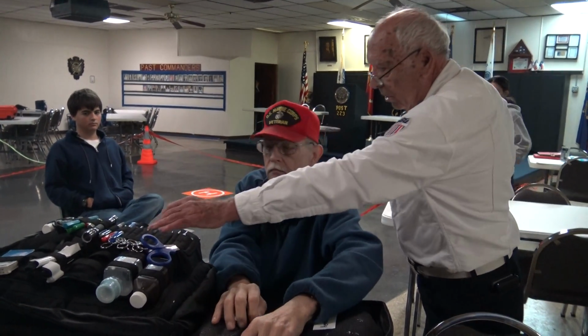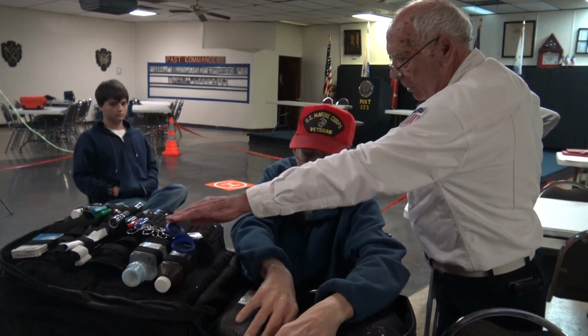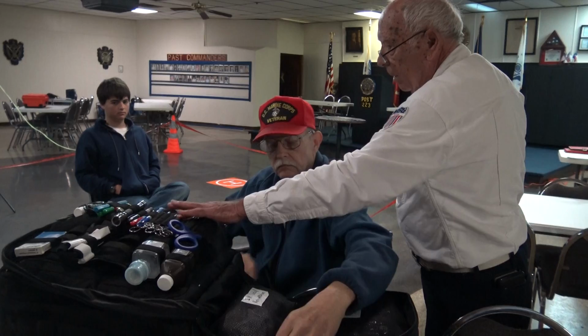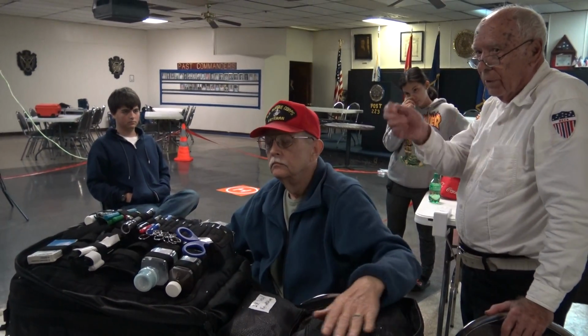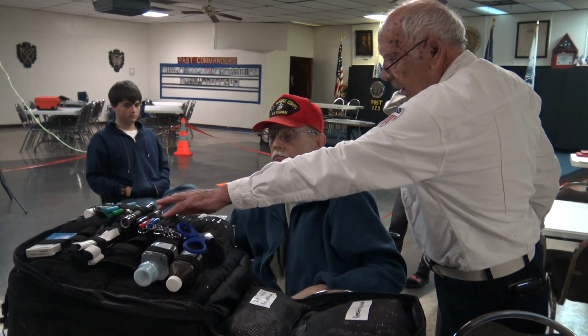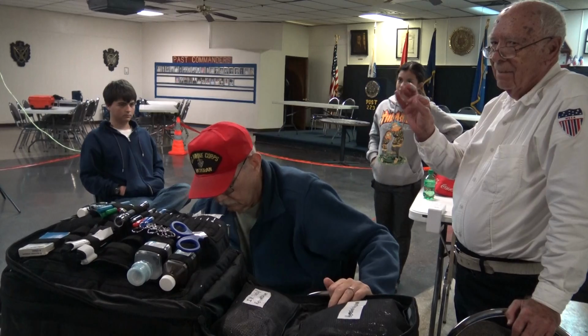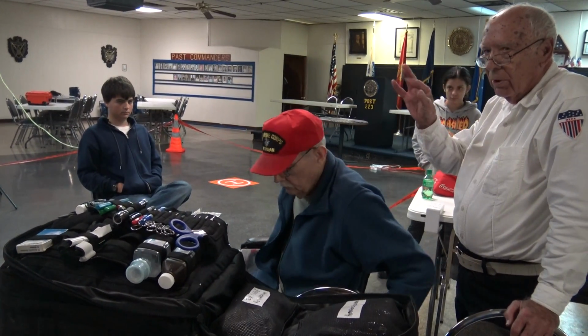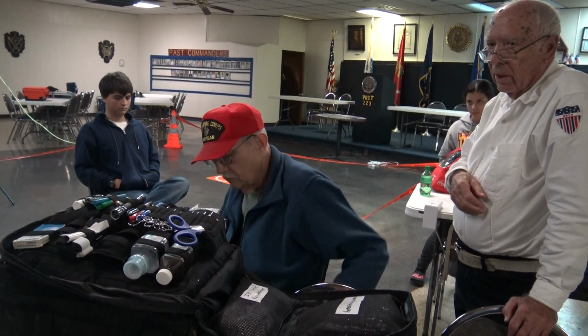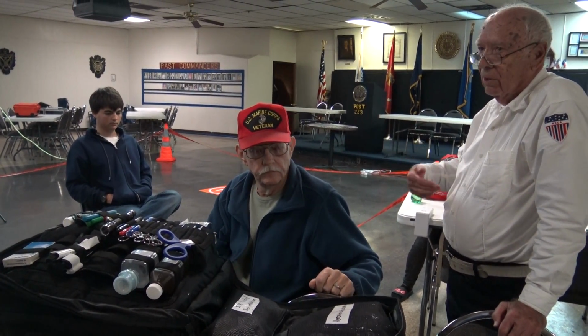So some of the surgical instruments are here. I have a kit like this at home, but mine's surgical. These are the surgical instruments here. You have needle holders to hold the needle. I actually have suture in mine. Okay? And then you also have hemostats. Hemostat is what it says, hemostat, stop the blood. You put it on any bleeders that you can. Okay, so if you go ahead and take the appendix out, obviously you're gonna have some bleeders.